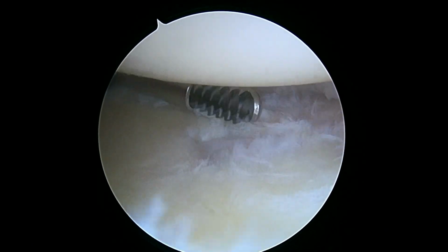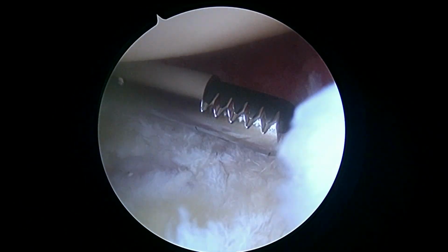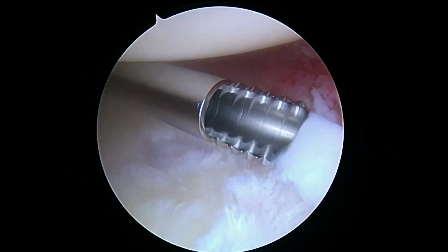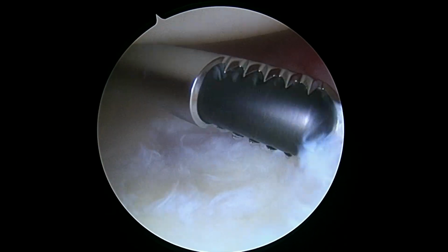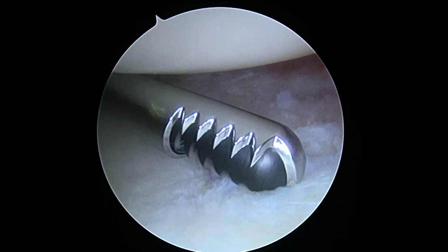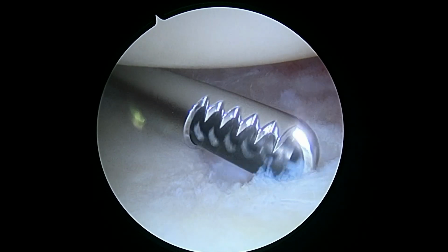Okay, so we're looking from the front to the back inside the joint, and you can see there's these areas here where the labrum's torn, and we're just trying to smooth out. Lift up on the shoulder, please. We're trying to smooth out these areas here with our shaver. We're just about done with this part. But you can see, like, here's a little, for lack of a better term, here's a little pothole in the glenoid articular surface here. I'm just making sure there's nothing really loose.